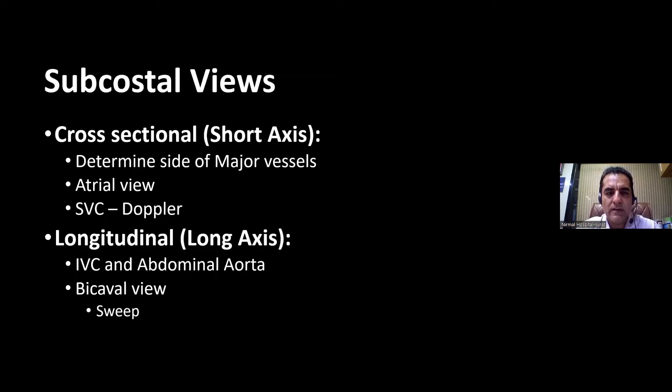And then we have the long axis, where the pointer is pointing at 12 o'clock position. Here we will be seeing mainly the IVC and the abdominal aorta.